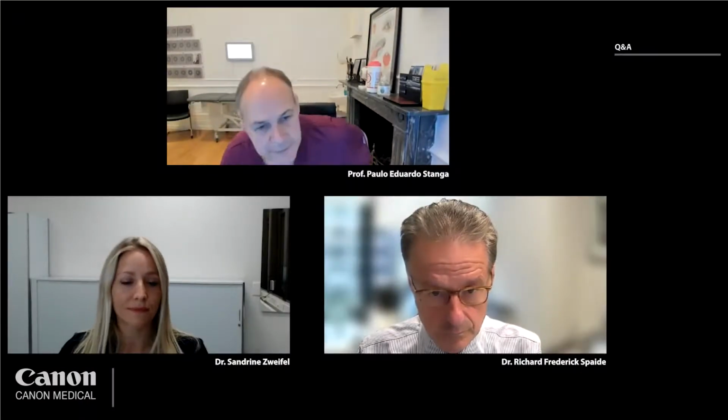Thank you very much, Rick, for that fantastic presentation. So the floor is open for questions. We don't have much time, but we do have time for some questions. Let's see if the audience submits some. Here is the first one.